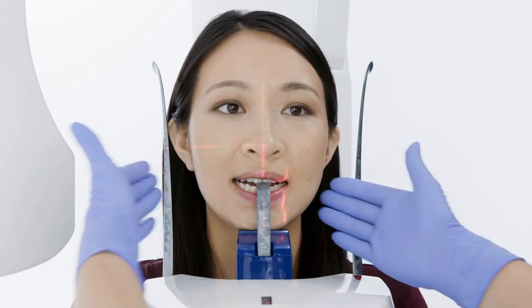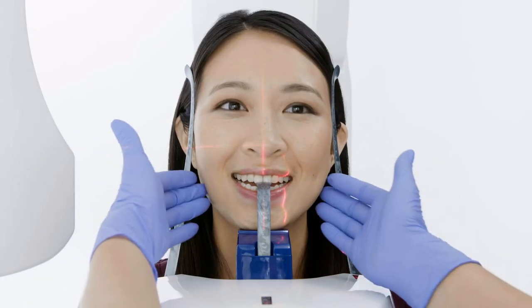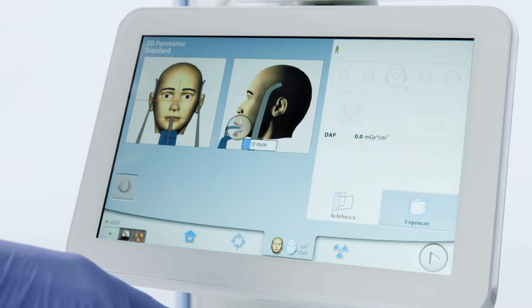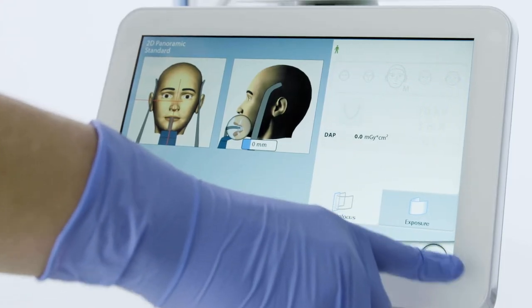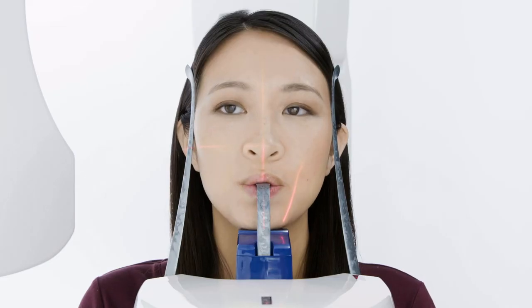Have the patient smile wide, and raise or lower the unit until the posterior occlusal table is at a slight downward angle. Close the temple supports and align the mid-sagittal laser between the eyes by moving the head left or right.